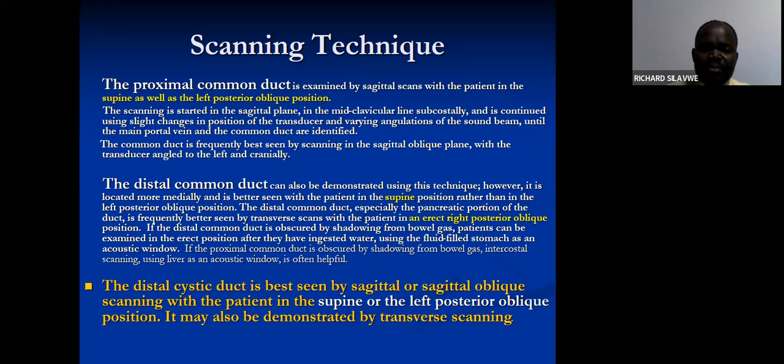If the distal common duct is obscured by shadowing from bowel gas, the patient can be examined in an erect position after they have ingested water.